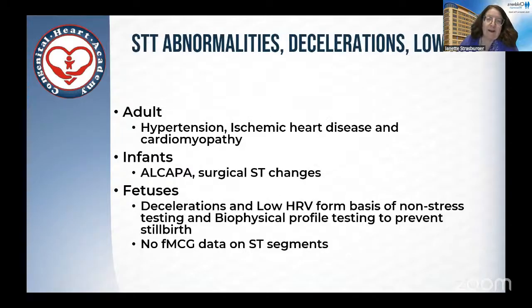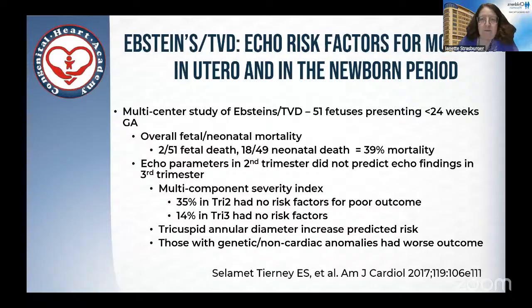And I'm not going to go into ST abnormality because that could be a talk all into itself. But if you look at what we do in the fetus, ST assessments are important in looking at decelerations and low heart rate variabilities, and these form the basis on which we do non-stress testing and biophysical profiles across all of the later gestations in the fetus. But right now, we have not published our work on ST segment abnormalities, and part of that is that we are still acquiring more information about the ST segment assessment, and so I think it's yet to come.